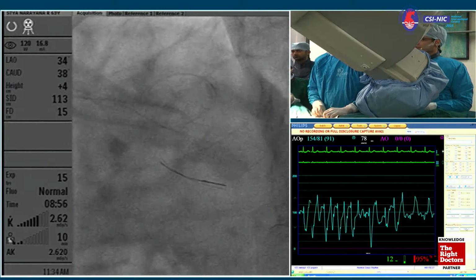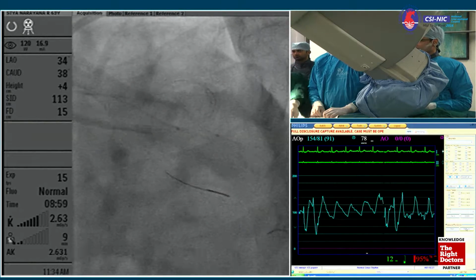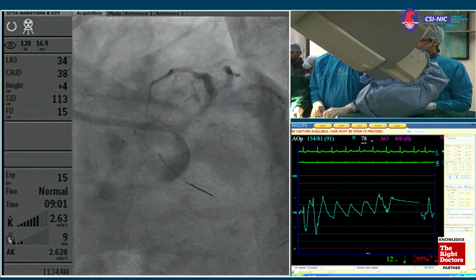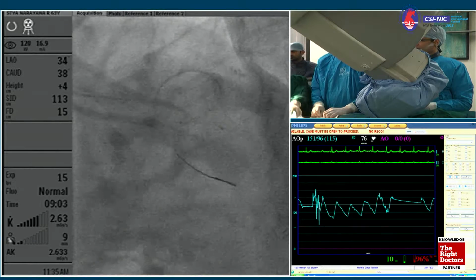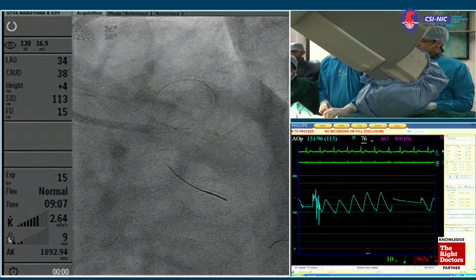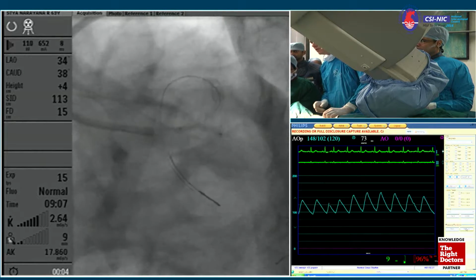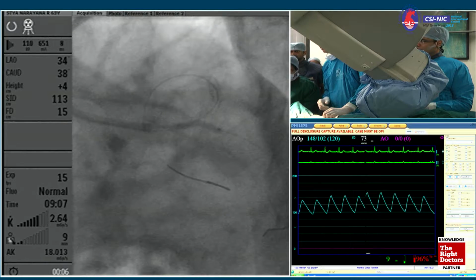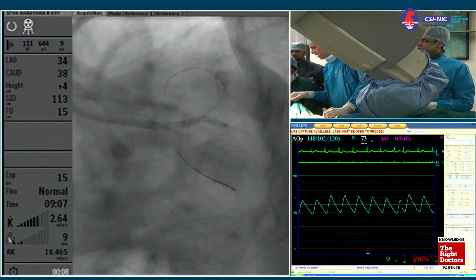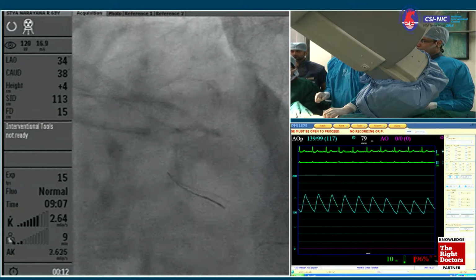Any comments about using an imaging technique? In this case, with Dr. Naber's case, when he's doing left main, I think intravascular ultrasound will be helpful, particularly as it's a calcified lesion and he had difficulty getting the balloon across. A pre-procedure IVUS would have given us a lot of information, and maybe rotablation may have helped us. In any case, one always leans towards doing imaging when you are handling distal left main.